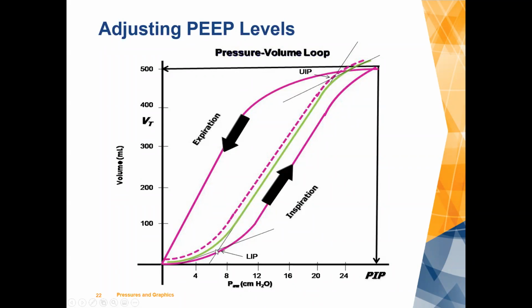The green line in the middle, you're kind of drawing a tangent where you see at some point early on, you're getting more volume for each concomitant increase in pressure. So that's where the balloon gets easier to blow up, all right? That gives you some guidance as to where PEEP should be set. It's not 100%, but it gives you some guidance, okay? A centimeter or two above that is not a terrible place to actually set your PEEP. In this case, it would be crudely around 7 or 8 of PEEP, okay? And again, for the upper portion, trying to set your volumes in order to minimize that bird's beak.